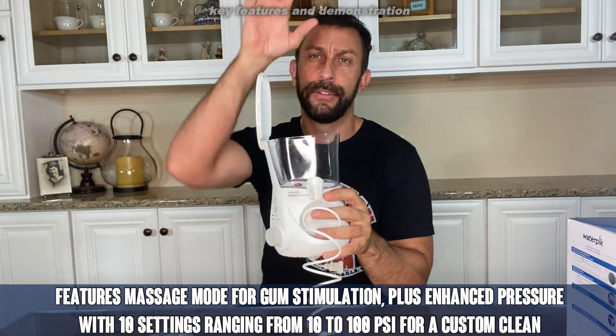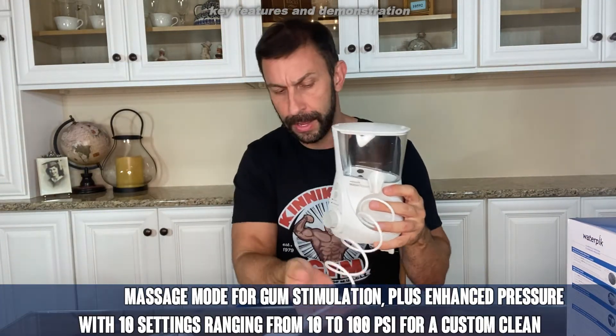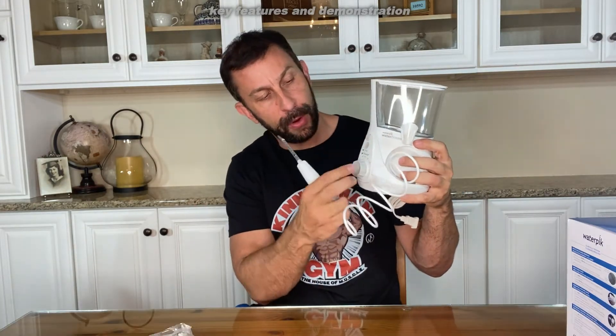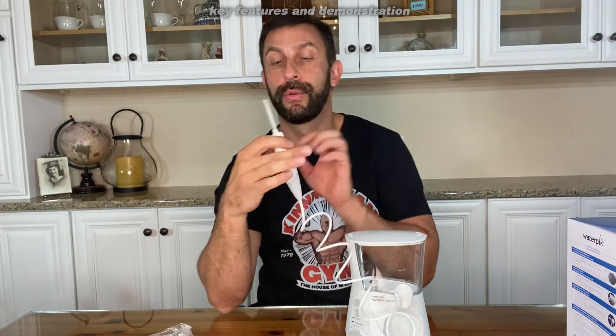So what are you going to do when you get it? First you're just going to put water in it, which is easy to do — just pour water in it. Then you're going to plug it in, press the power button, and crank it up. You're probably going to crank it up to 10. This thing is super powerful — if you turn it on, it's going to spray 15 feet easily. This is incredible.